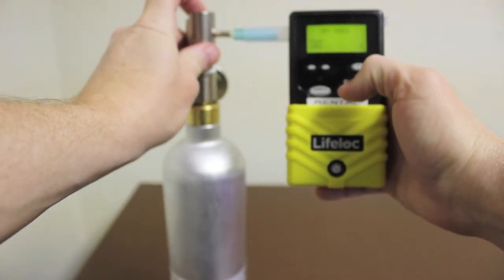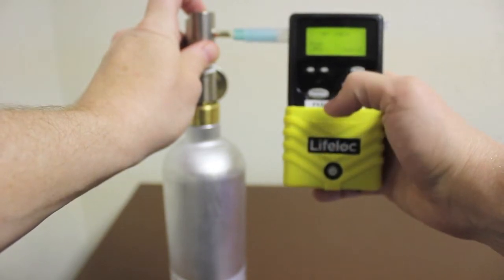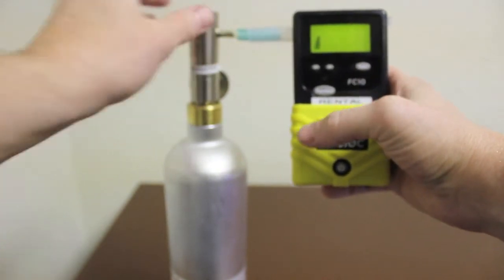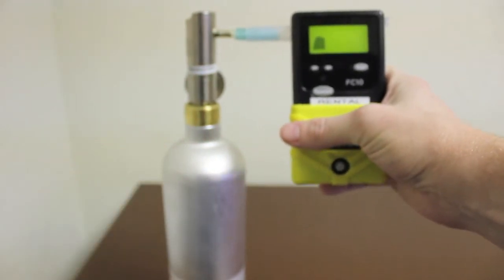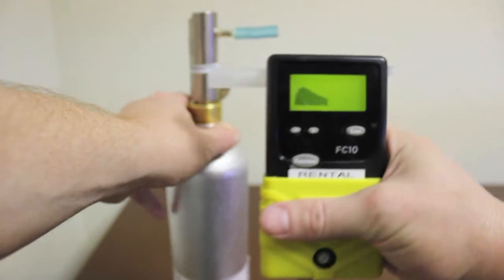Start releasing the dry gas and press the execute button to begin a countdown. When prompted to take a sample, press the execute button. When the sample has been taken, stop the gas. The alcohol curve will display, followed by the calibration result.